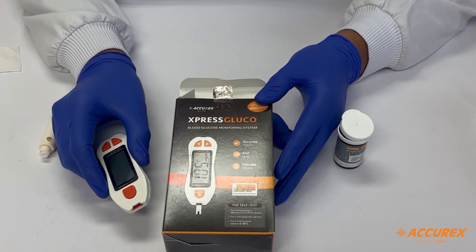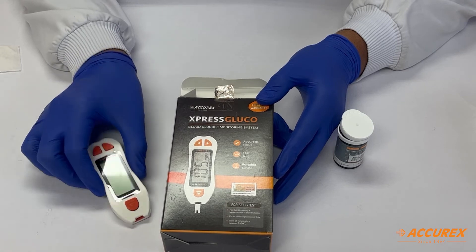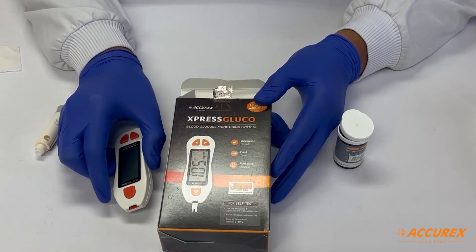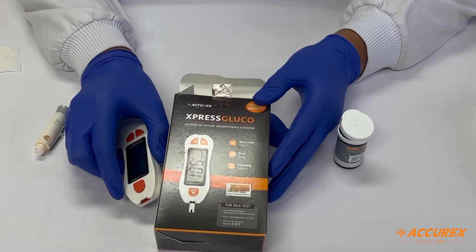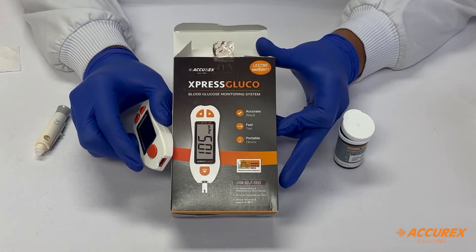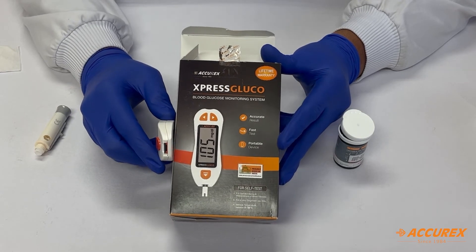Express Gluco comes with a feature of fast results in just five seconds, a lifetime warranty, along with ISO certifications. Take a step towards a healthy lifestyle with the Express Gluco blood glucose monitoring system. Thank you.